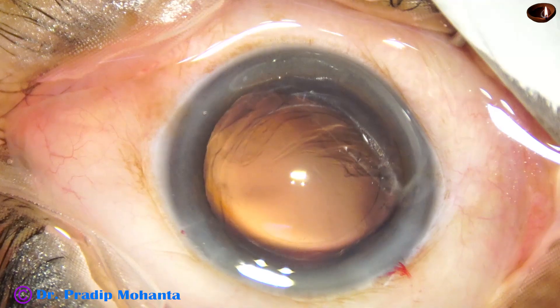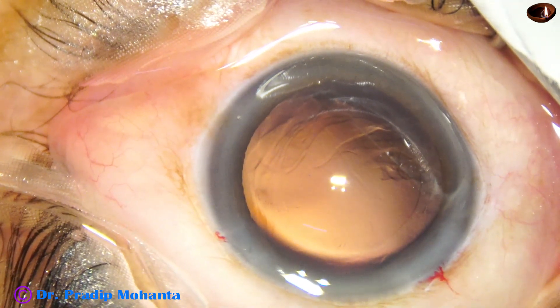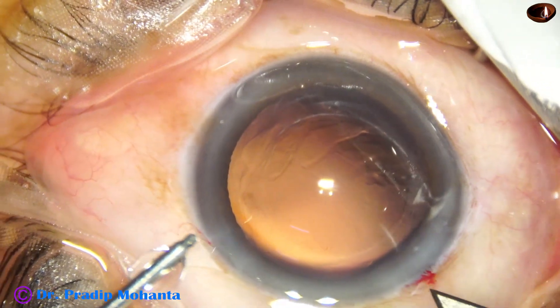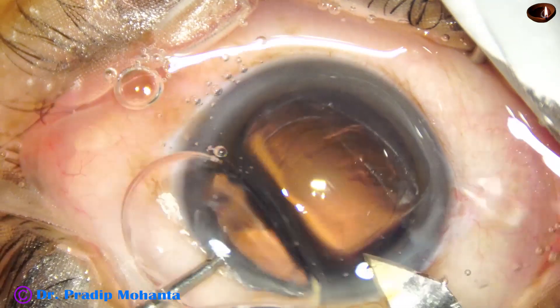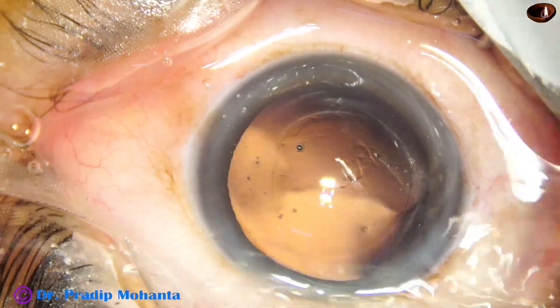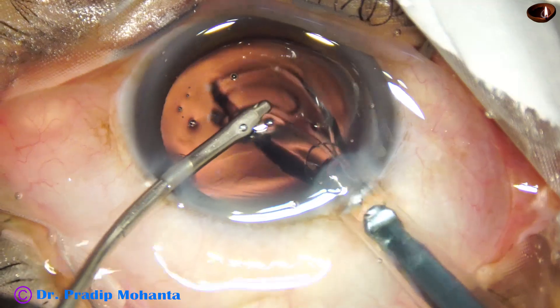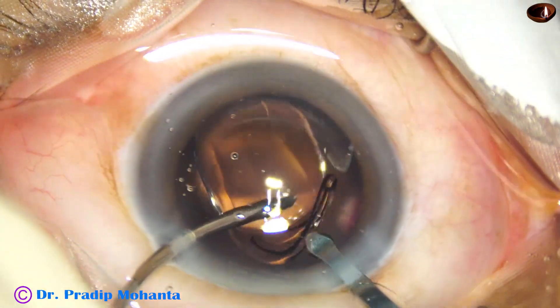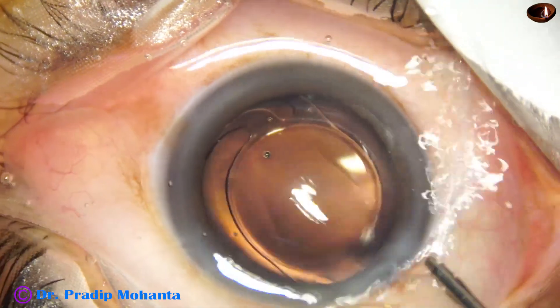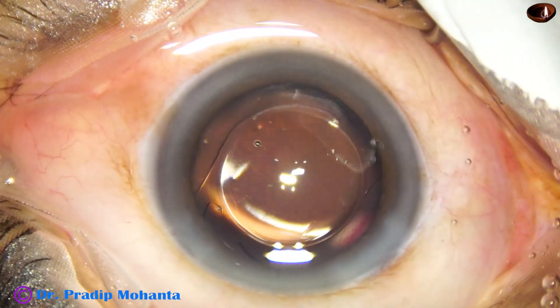Now it is time to do hydro-implantation of a lens. I am using a B cartridge, which is useful because it does not compress the optic of the intraocular lens much, and the lens does not get stuck at the wound. For this we need to enlarge the main wound by 0.2mm — the wound that was 2.8mm is now 3mm. Now here goes the lens into the capsular bag; we just have to dial the lens a bit.